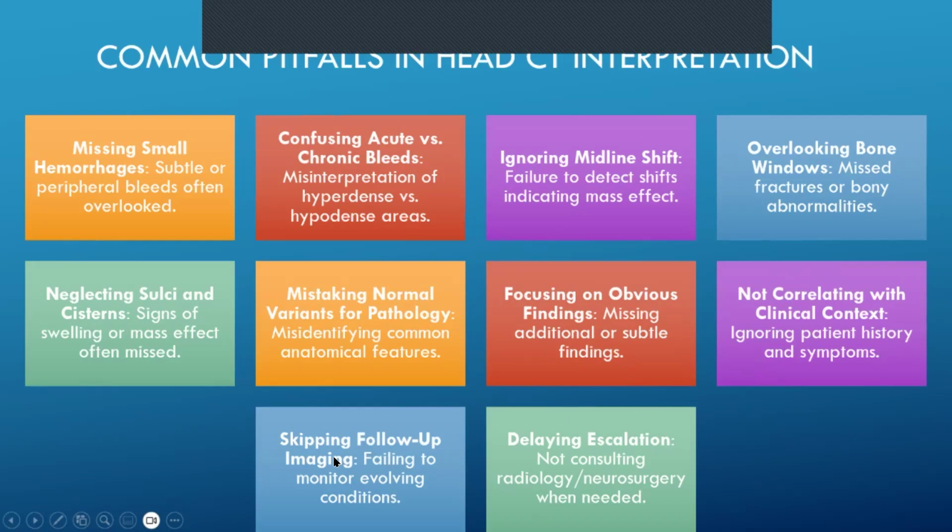And skipping follow-up imaging, although it doesn't really affect us as much in the emergency department, if you are working in the ICU or in a high care unit, this may be something that you need to look at. If I didn't see anything on the first run, doesn't mean that there's nothing there. You may need to rescan a patient. It may need to be done quite soon, or sometimes a few days later. And if you are not sure, escalate it to somebody within your hospital, within your department, to somebody at a referral center, but escalate it.